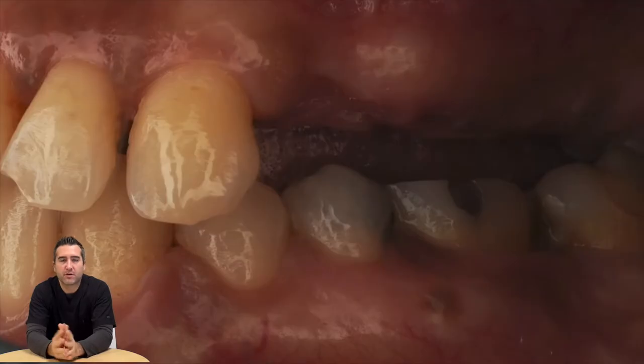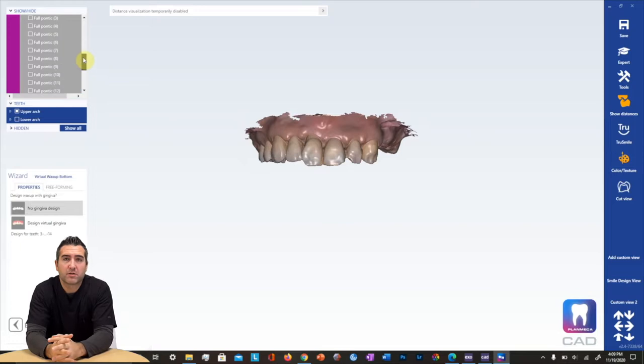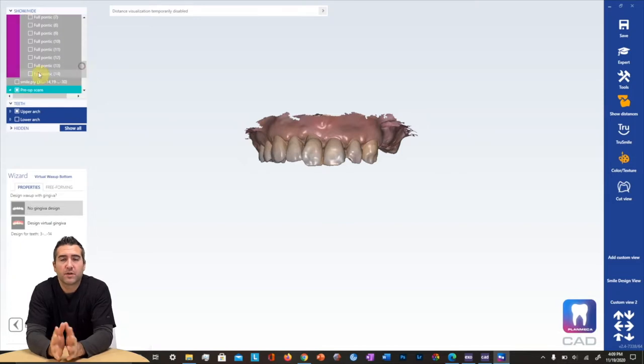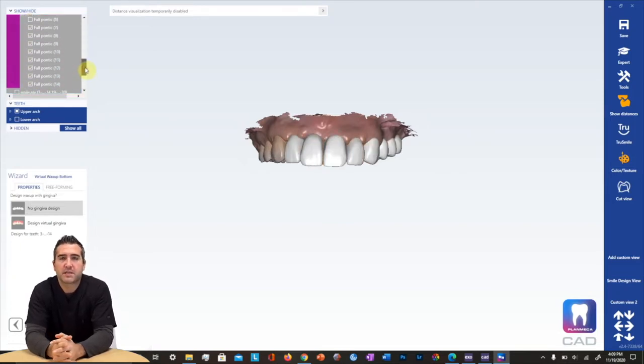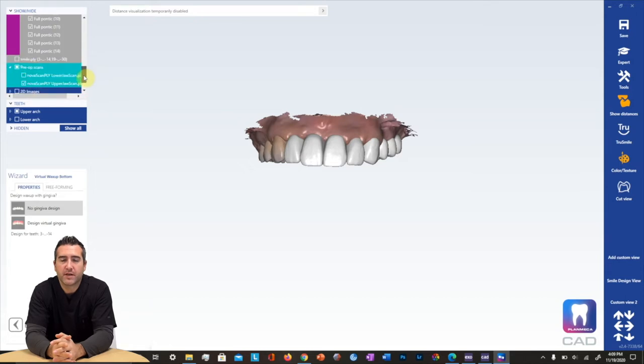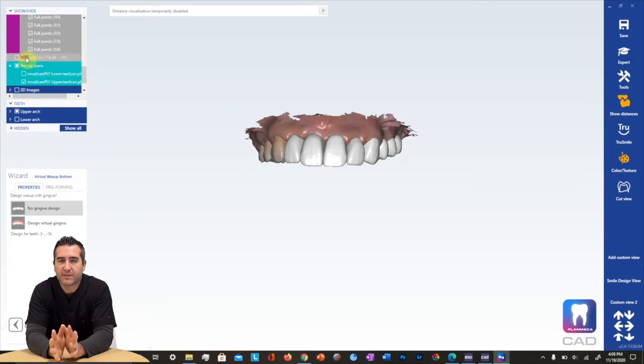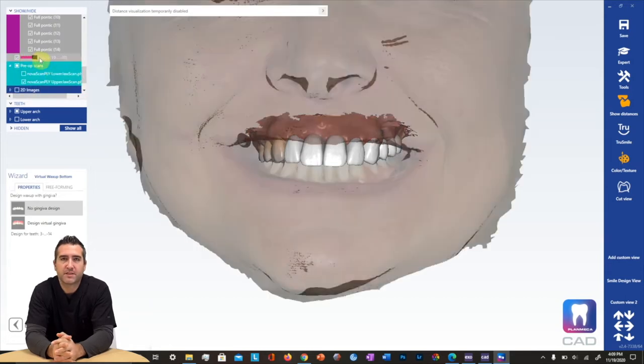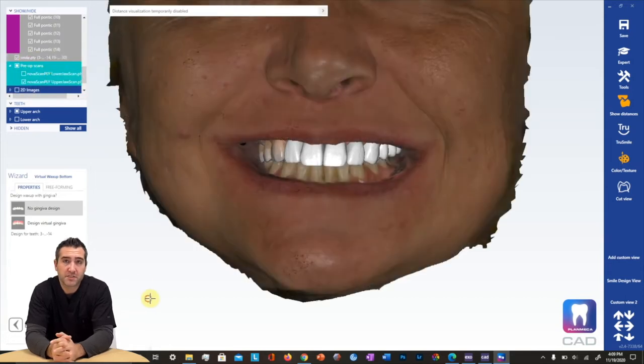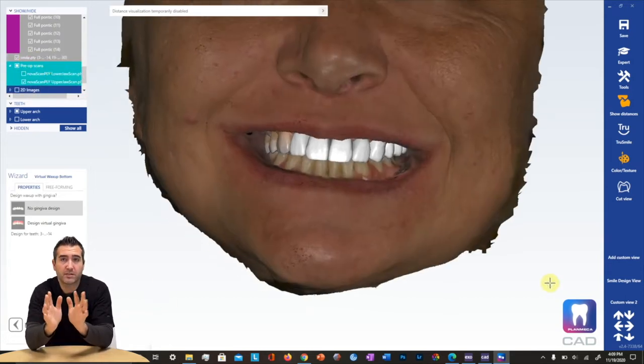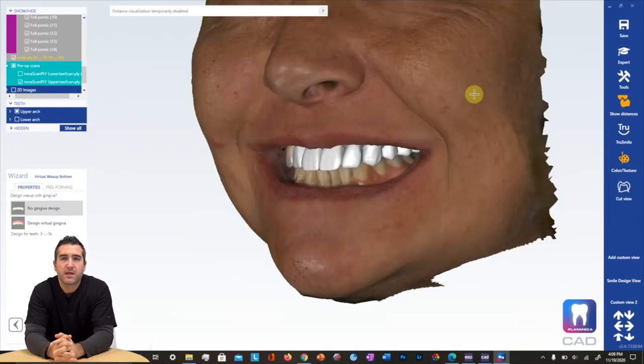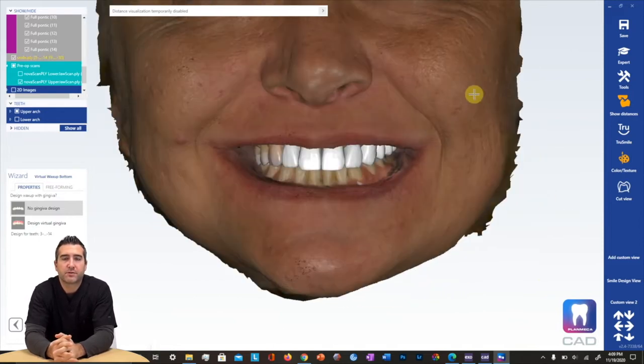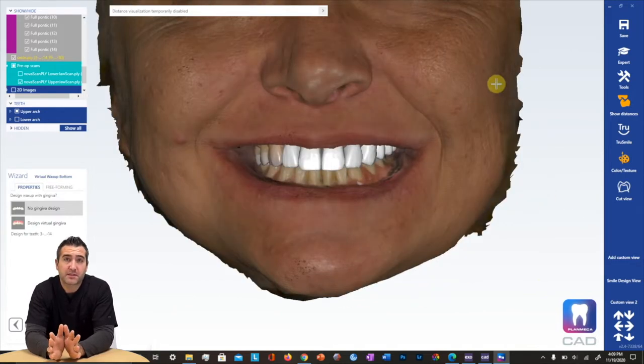So we're gonna extract seven all the way through eleven and we're gonna place some implants and immediate load a prosthesis. The first thing that we do is we take super high quality intraoral scans and we go ahead and do 3D face scans and everything ultra low dose CBCT. We put all this stuff into PlanCAD Premium and you can see here we're doing an outside-in approach to the smile design.